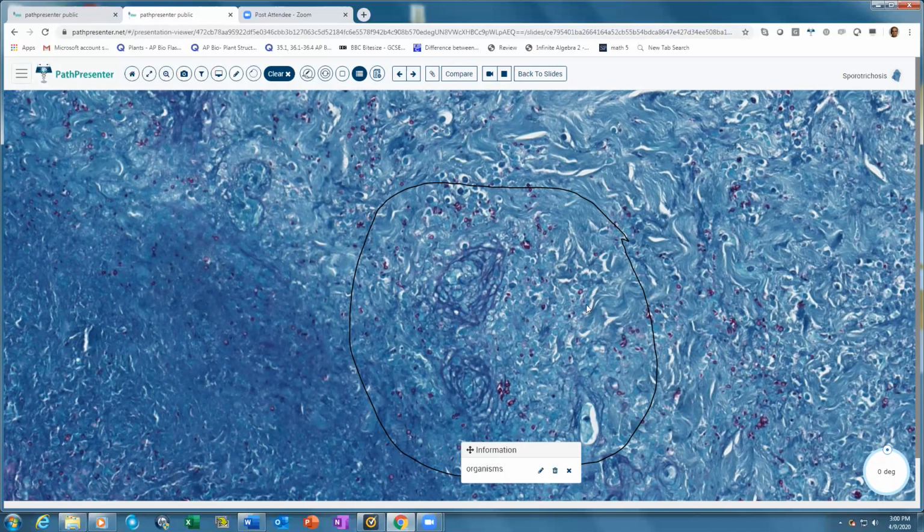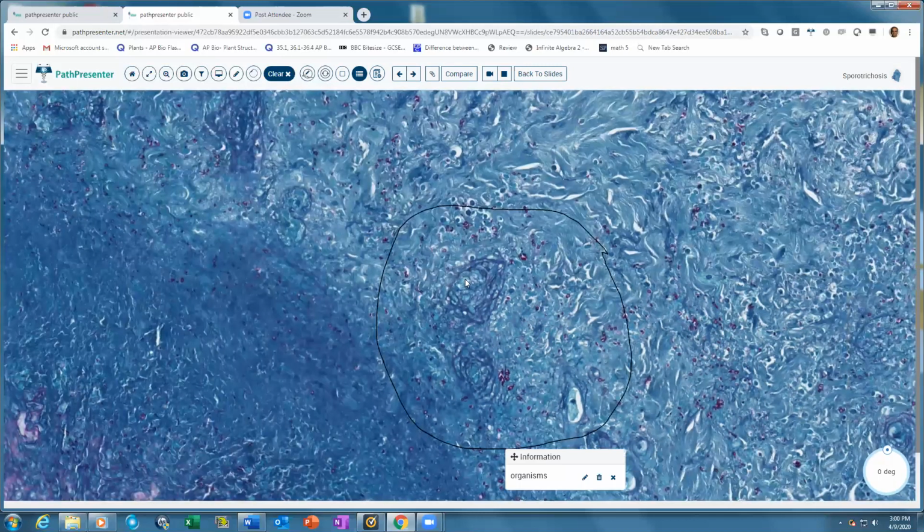And you might also see some stellate neutrophilic abscesses surrounding the granuloma. So that has been described, even asteroid bodies may be noted. So all of them have been described with sporotrichosis. But they normally present with this cigar shaped and round yeast forms that are very easily seen on the PAS and the GMS, but very hard to see on the H&E basically.